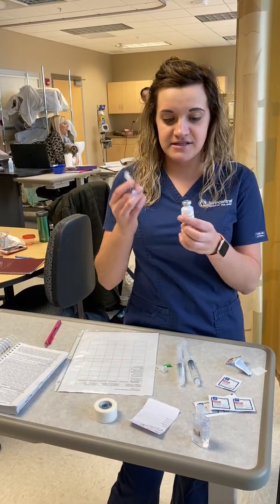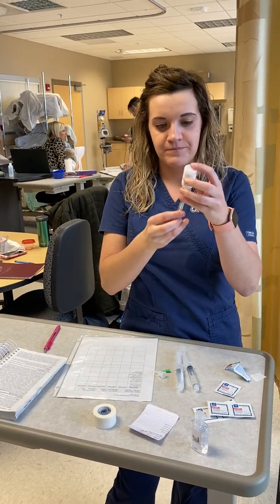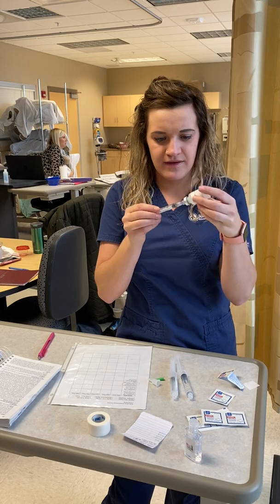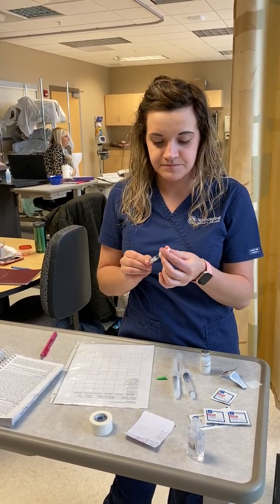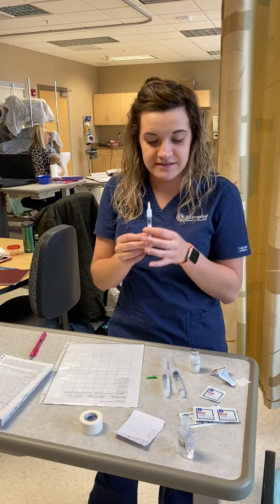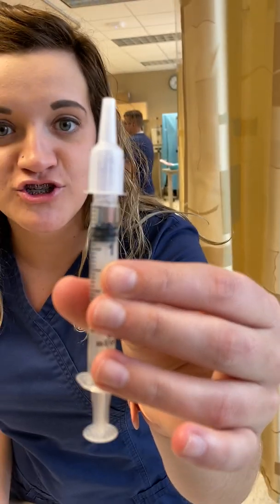So I know the top of this is dry. I'm going to go ahead and hook up and get the dose accurate here. Okay, so it looks like I'm accurate. You want to go ahead and look: 0.5 mLs for a dose of 1 milligram IV push.